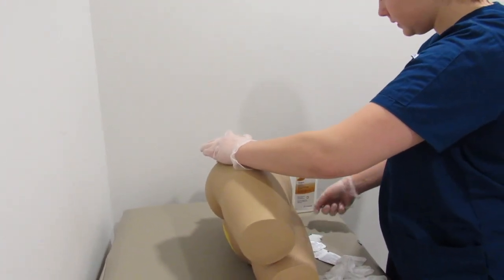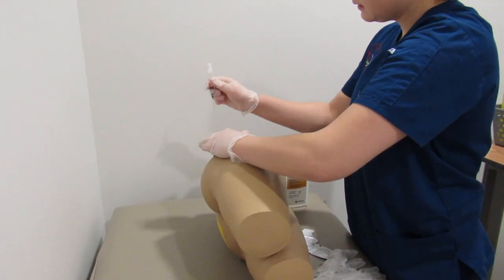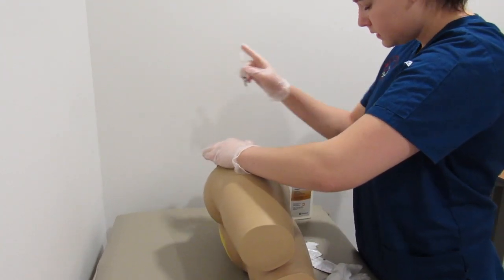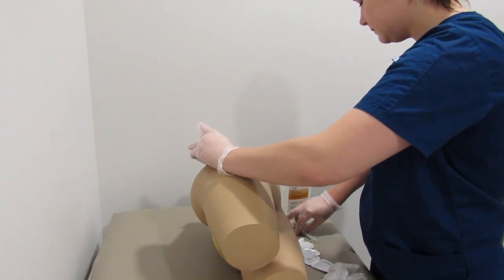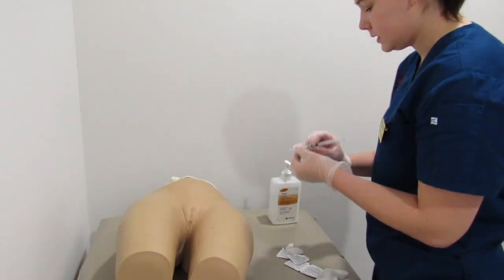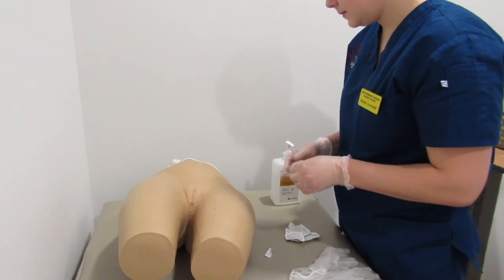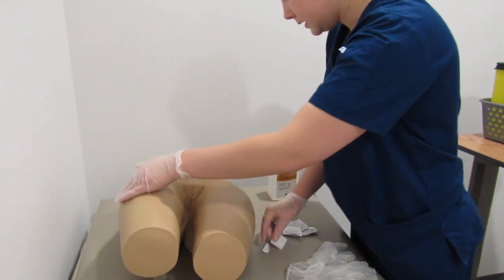Take the cap of the needle off and pull the skin apart. And you're just going to feel a slight pinch. And there you go. And you can roll back over. And I'm just going to dispose of the needle in the sharps. And I'm just going to clean that site one last time. A little bit, there you go. And you're all done.